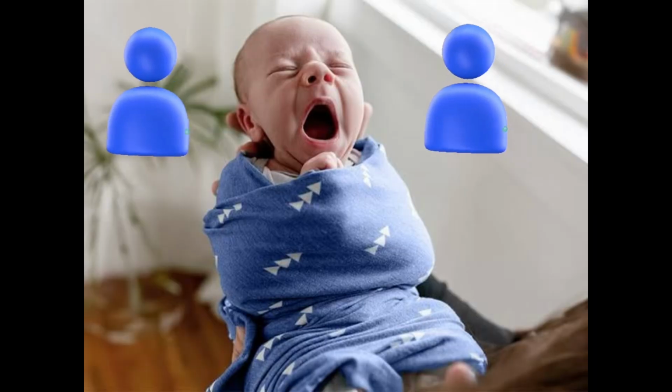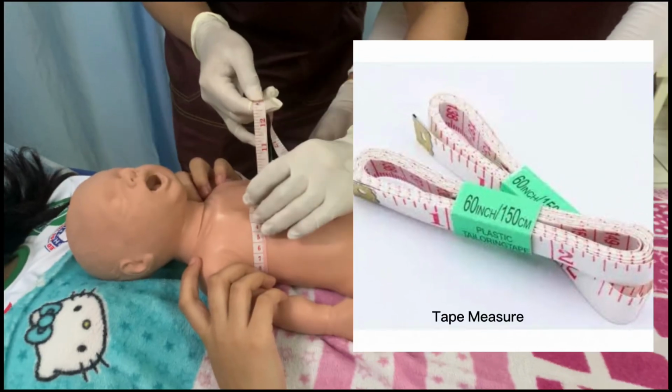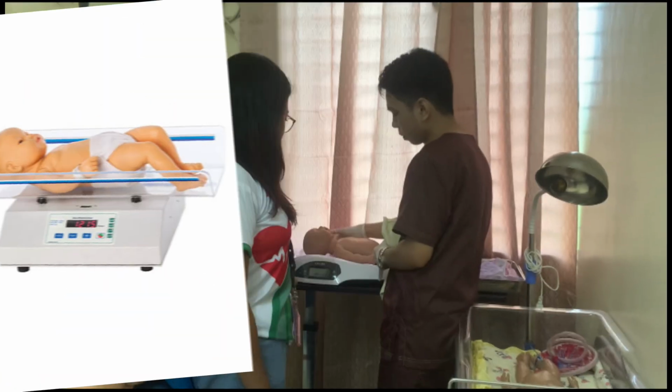Another supplies needed for the general characteristics of the newborn or the anthropometric measurements. We need the measuring tape and the weighing scale of the newborn.